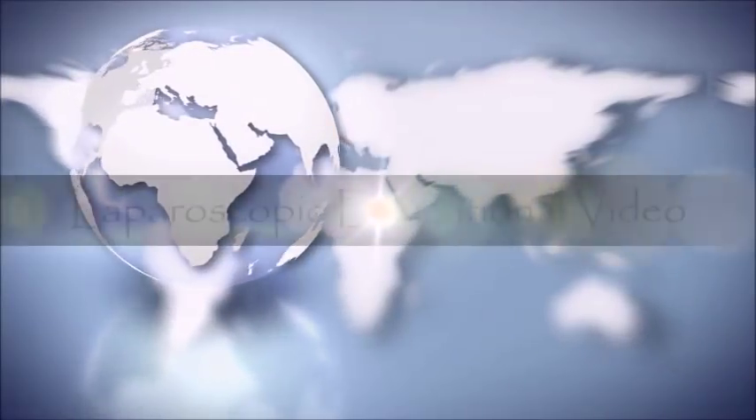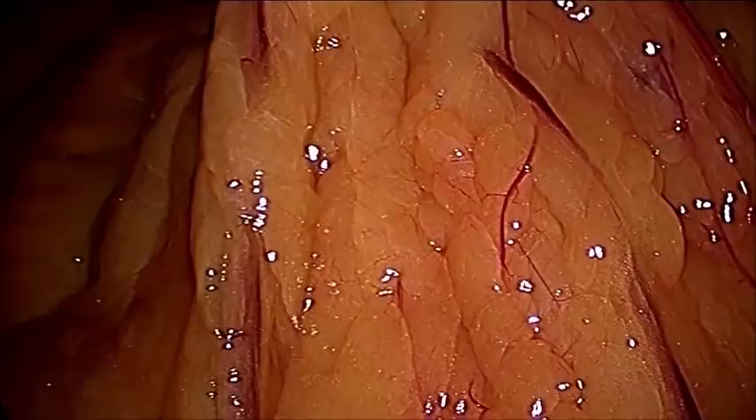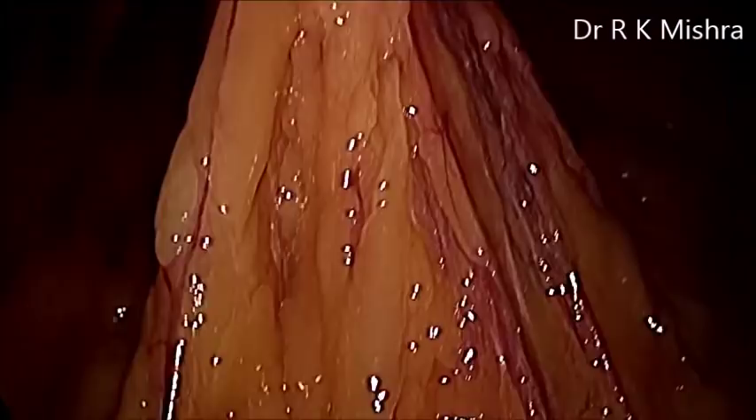Hello, this is a case of laparoscopic repair of umbilical hernia. This patient has a 4 cm large umbilical hernia in the umbilicus. There is a lot of omentum which is adhered there. We have seen the bowel component and there is no dilated bowel loop.